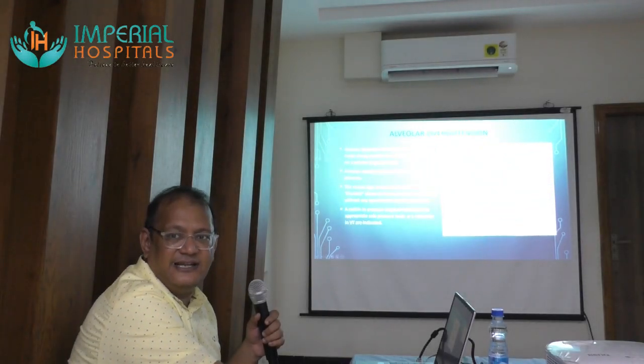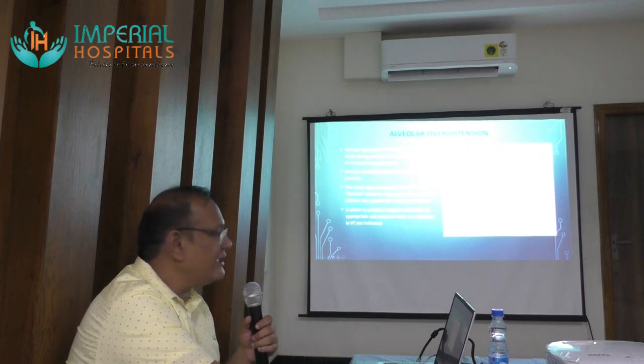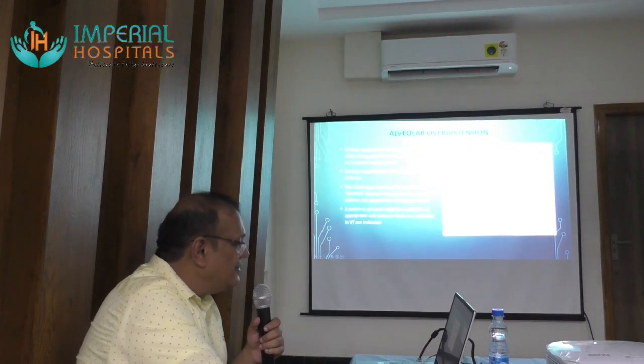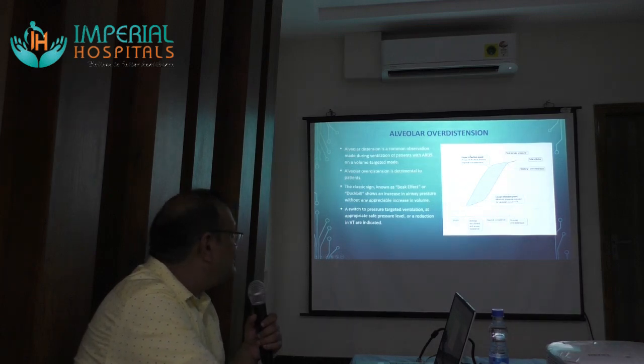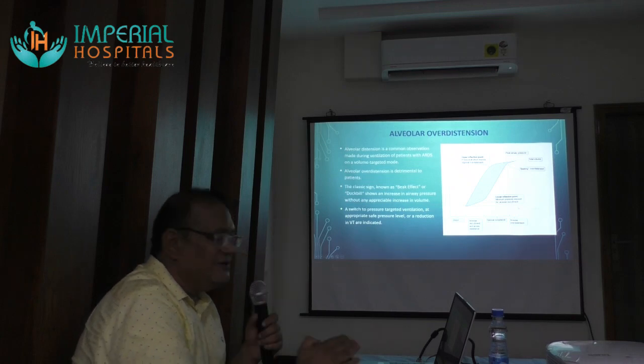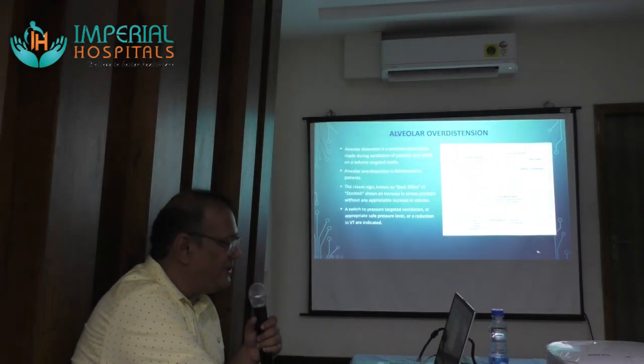This is an indication that the patient can have alveolar rupture at this point. This is known as the beaking effect or duckbill effect. So when you see this, if it is pressure control, you need to decrease the set peak pressures.